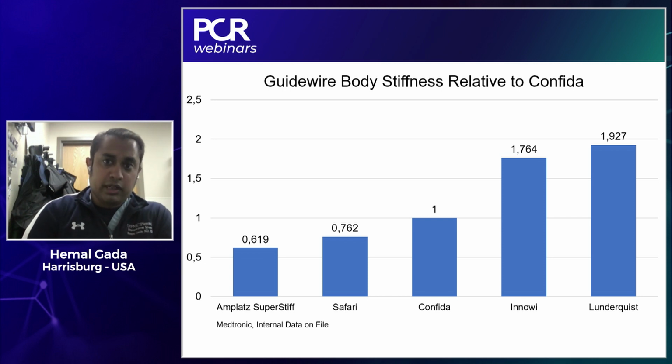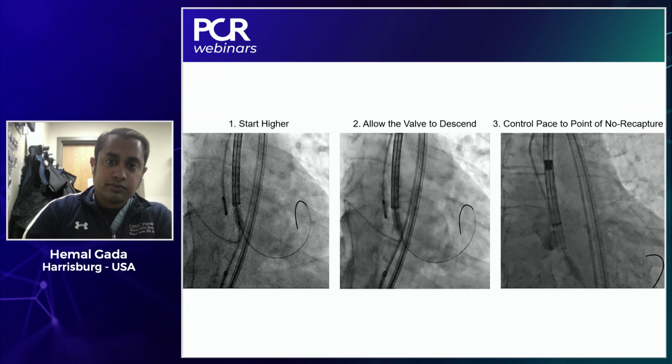And I think you can eradicate all of that by having a stiffer guide wire in place in the left ventricle that will stick to the posterior aspect of the annular plane and the non-right commissure more effectively. Our wire of choice to this point is the double curve Lunderquist wire. It is a safe wire to use if you know how to use it. And now we have good safety data coming out of a post-market analysis called Optimize PRO that I'll share with you towards the end of this session.